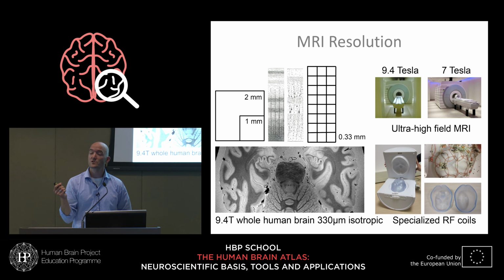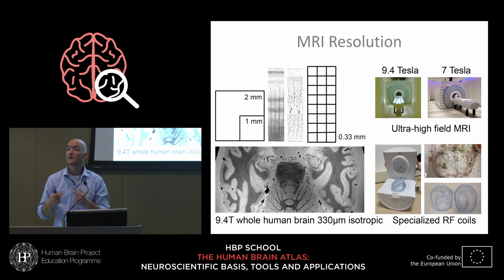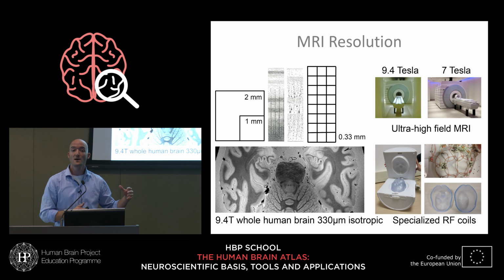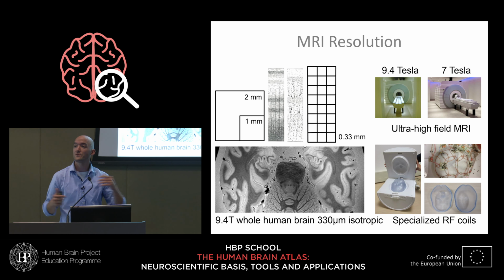On the other hand, since we are squeezing for every ounce of SNR, even when you do standard, non-accelerated, 3D Fourier transform encoded imaging, when you look at your image reconstruction, we don't do what the scanner always does. For instance, all of these coils each produce one separate image. One image looks like it was taken with a lamp on this side of the brain, another looks like it's taken with a lamp on the other side. You have to combine them. If you do standard combination, you lose a lot of your SNR. You have to do complex combinations like Roemer combinations, or at least covariance-weighted noise combinations. So we do all of those, and we do all of those offline. When we measure for a weekend on a whole human brain, we get 4 gigabytes of raw data, and that goes into MATLAB, and it processes for 24 more hours to get 4 gigabytes of very high resolution images.